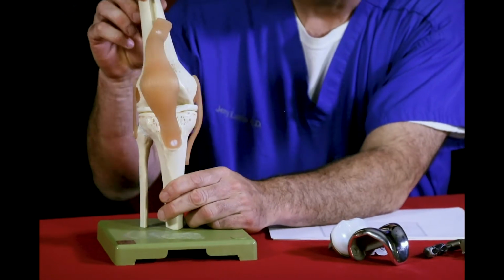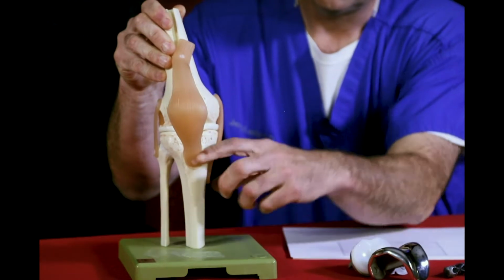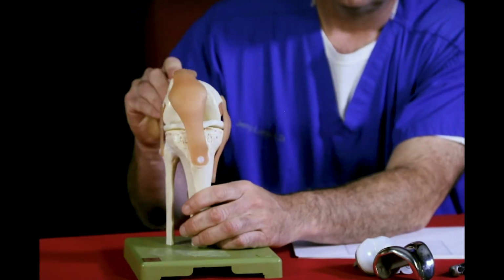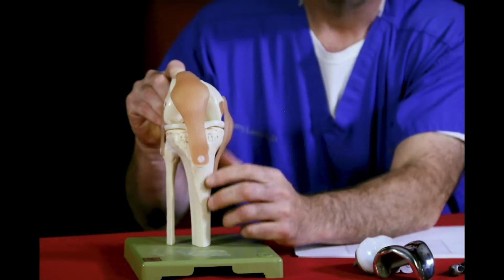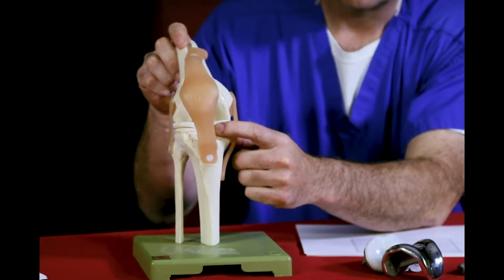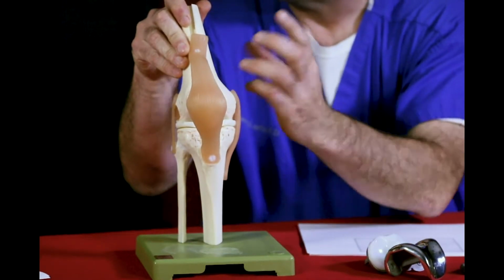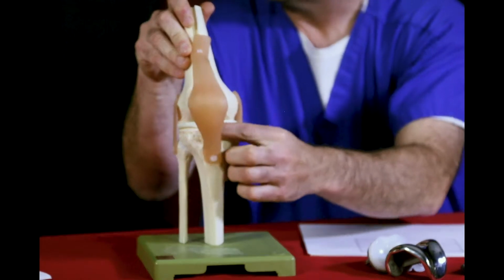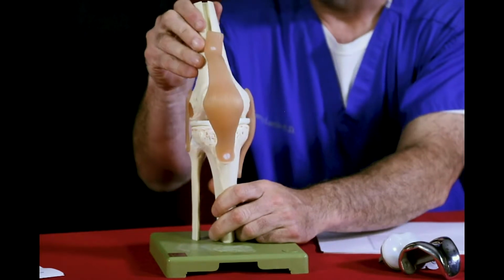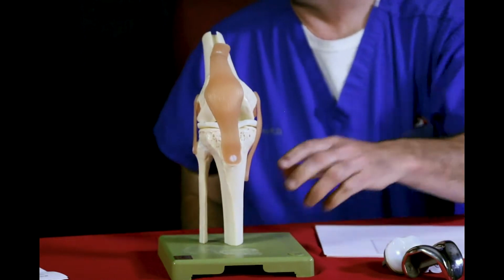So the one cut that we start with determines the extension gap, the alignment when the knee is straight, and that varies now from 3 to 7 degrees. The flexion gap is that cut I just showed you. That varies from 0 to 10 degrees. And the third component is matching the rotation of the tibial component. And since the femoral rotation varies, your tibia needs to go and match that. So you can't put it in the same spot every time. The goal is to not have a knee that's real wobbly when they wake up. You want it solid, and that's what we're trying to achieve.